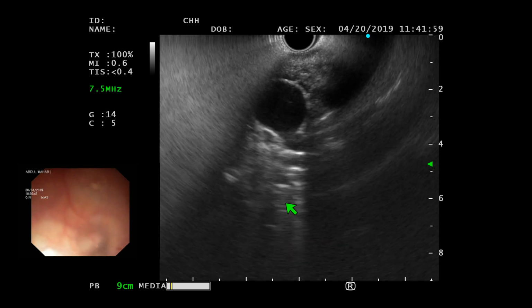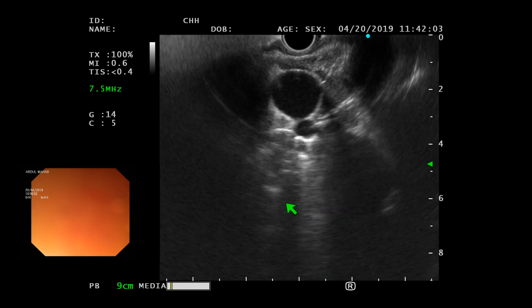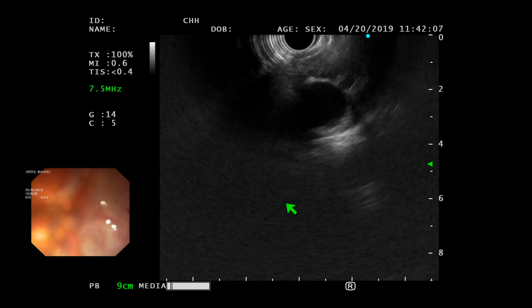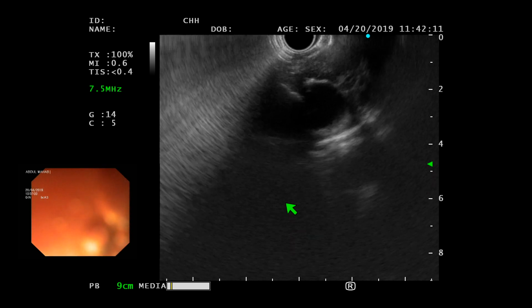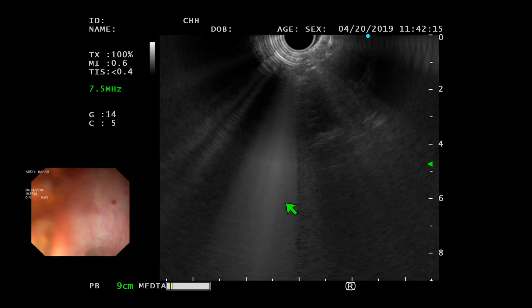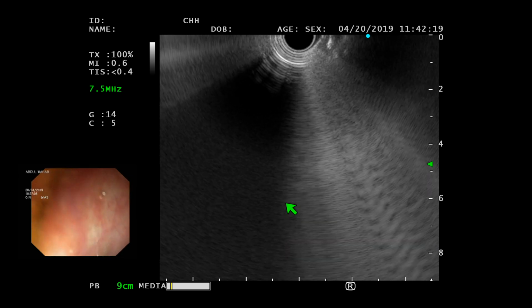You were discussing you being simple? I may have missed that conversation. So I usually go to 40 in women and 45 in men for my gastric station. I remember that discussion.